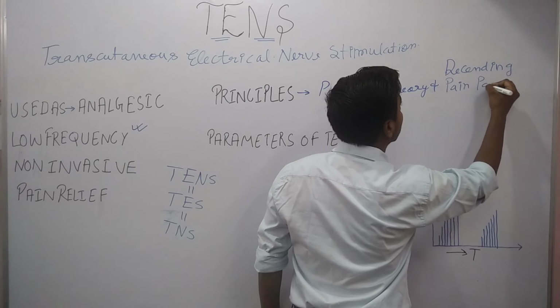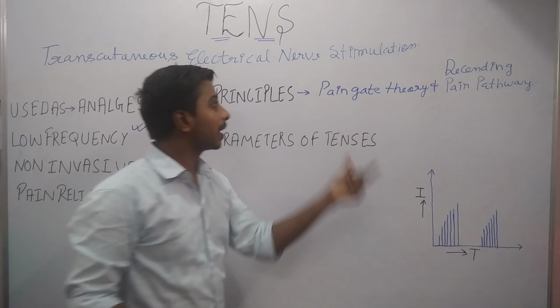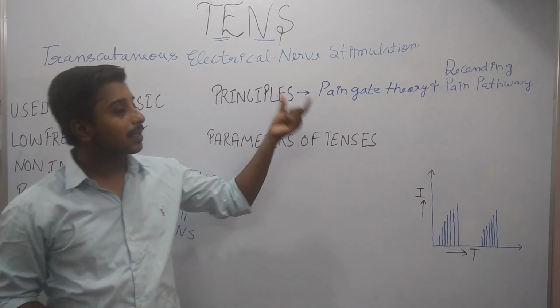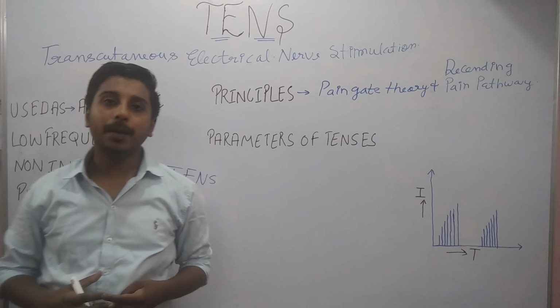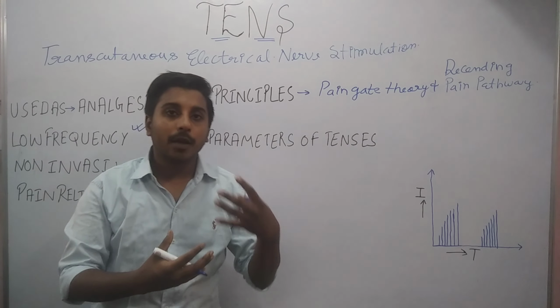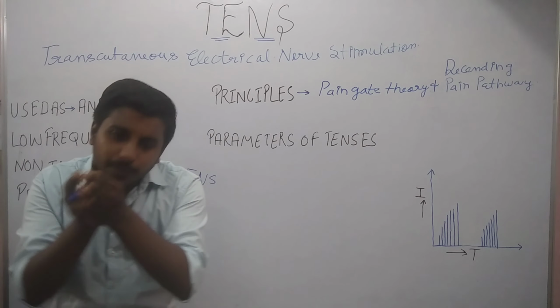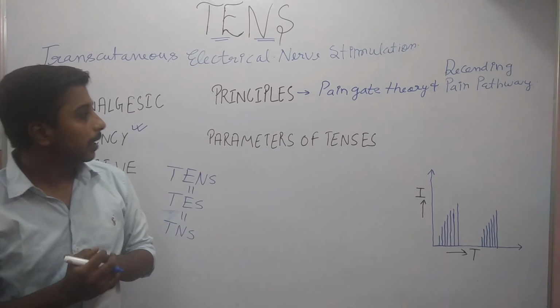Further in our video about modes of TENS, I will tell which particular mode uses which particular path of pain relief.